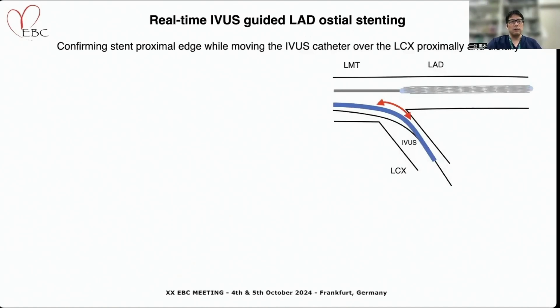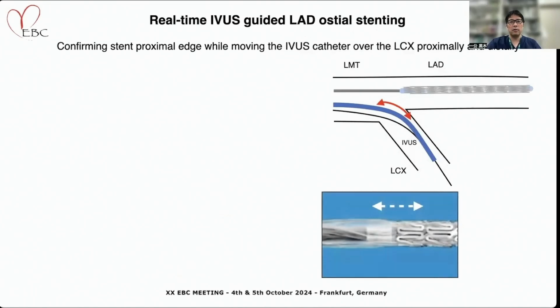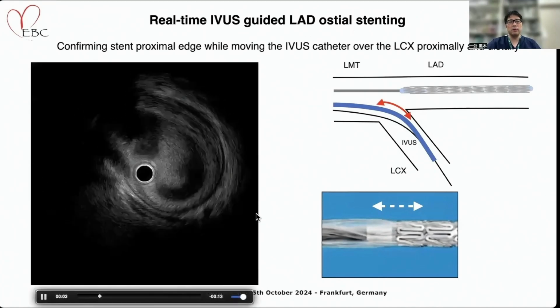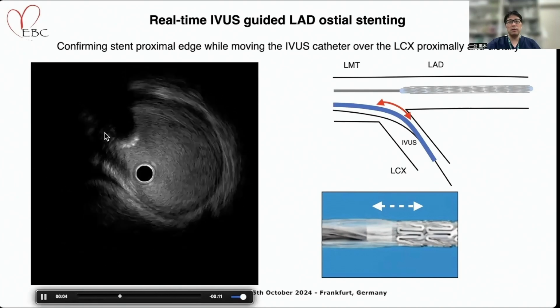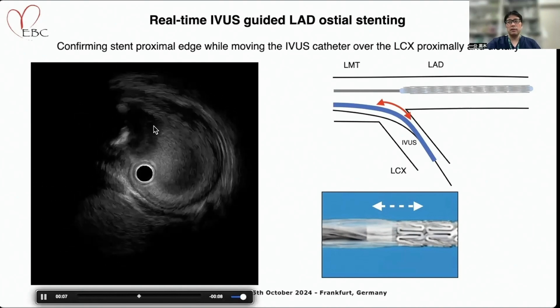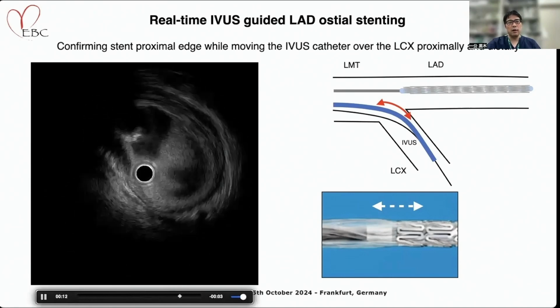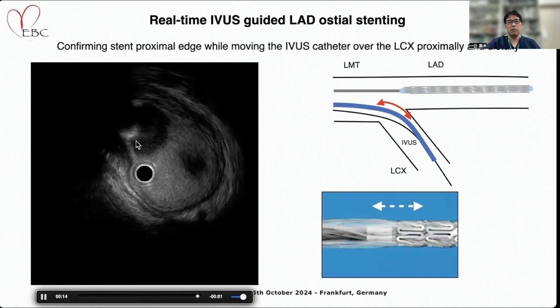So we inserted a drug-eluting stent to the LAD and IVUS to the LCX simultaneously. While the first operator adjusted the stent position, the assistant operated IVUS from the side branch. So we confirmed the position of the stent proximal edge while the assistant moved the IVUS catheter proximally and distally. This technique using real-time IVUS guidance allows clear visualization of the stent proximal edge and the ostium of the LAD without contrast media.